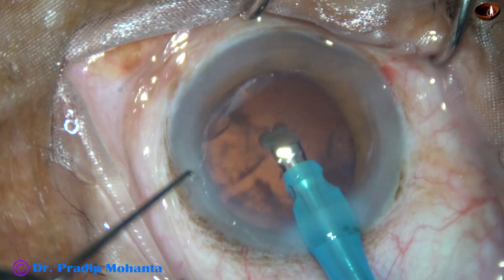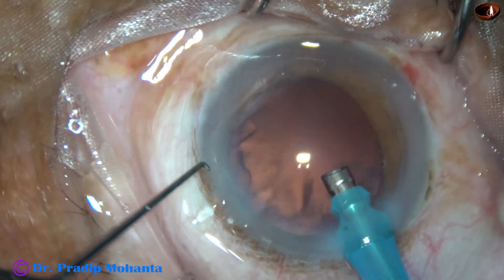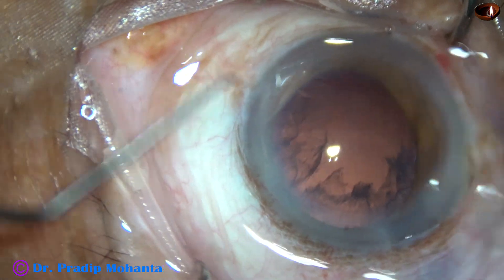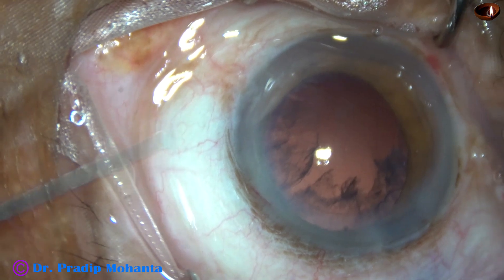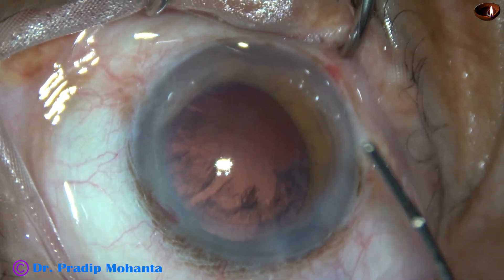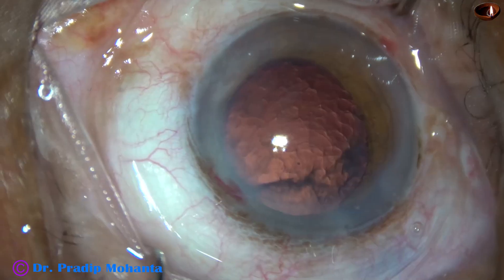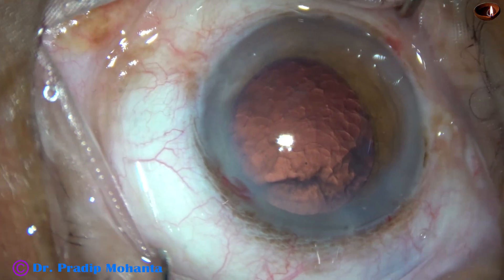Now I come to phaco mode 3, where the vacuum is less. So far the vacuum was 450 and flow rate was 45. Now flow rate is 25 and vacuum is 250. Ultrasonic energy used throughout the surgery is 85% in continuous mode, though it was being used intermittently whenever necessary.